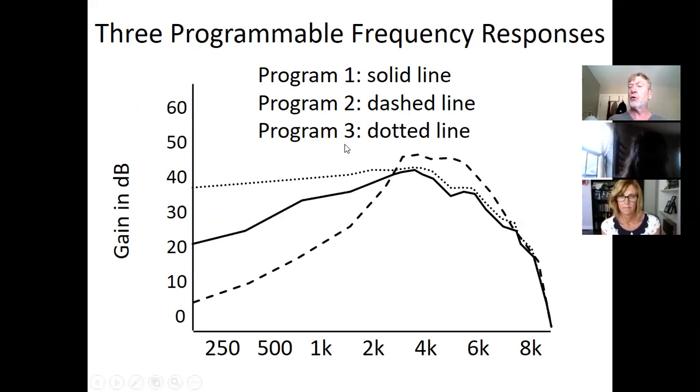Let's make a third program, because most digital hearing aids today offer at least 3 to 4 programs, okay? And you don't have to use them all. It depends on your client. Maybe your client's 89 years old and doesn't know how to turn on a hearing aid, so you're not going to mess with all these. But let's say your client is 65 and is still active, a grandmother or grandfather, but active, goes fishing with the kids on the weekends and whatever.